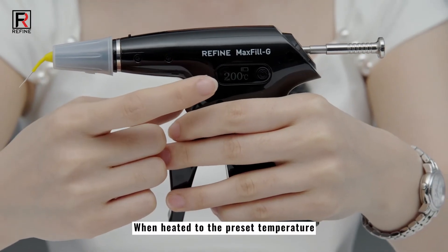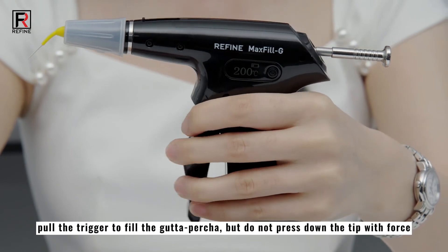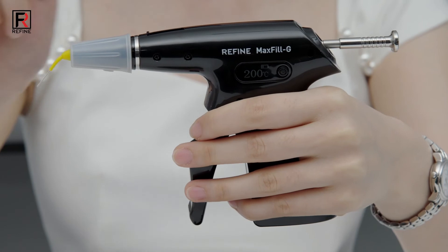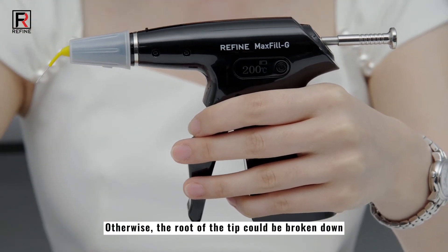When heated to the preset temperature, pull the trigger to fill the gutta percha, but do not press down the tip with force. Otherwise, the root of the tip could be broken down.